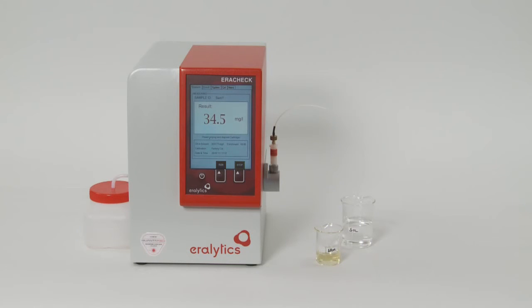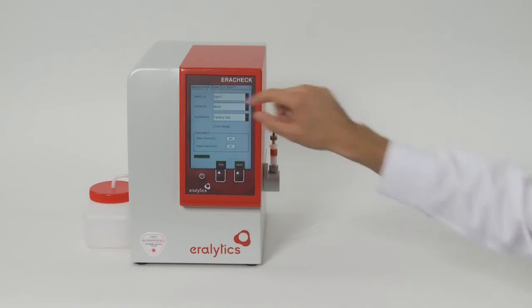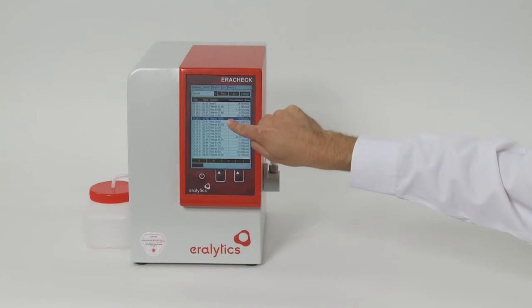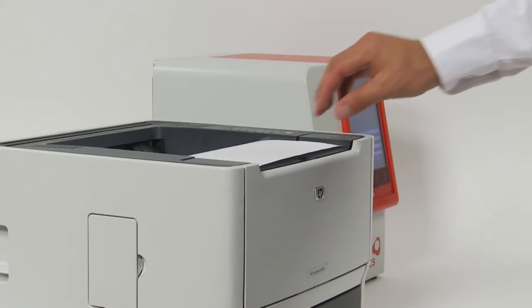In the result menu, several thousand results can be stored and reviewed. Each line displays a result; browse through the result memory using the cursor keys. The data can also be printed on a directly connected printer or via Ethernet connection to a LAN or network printer.